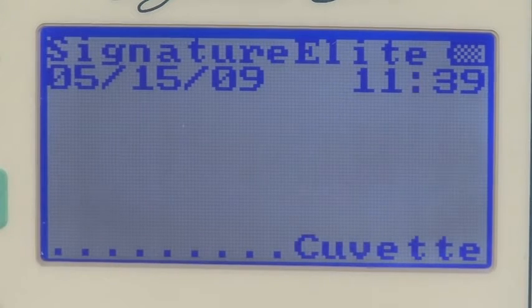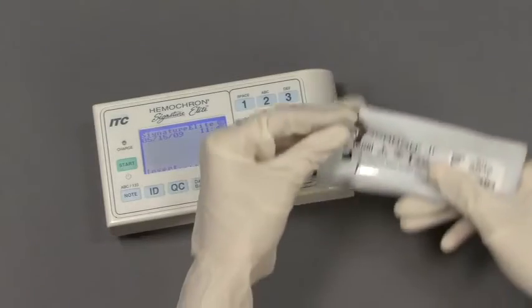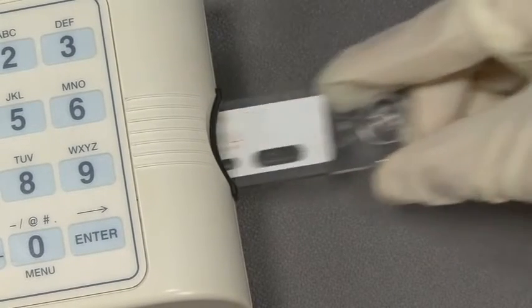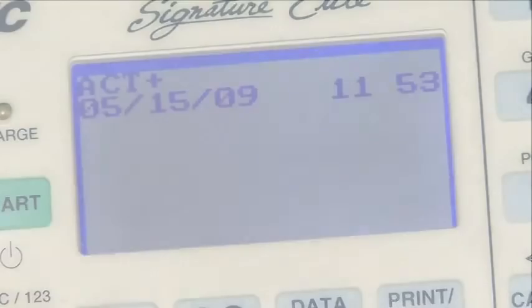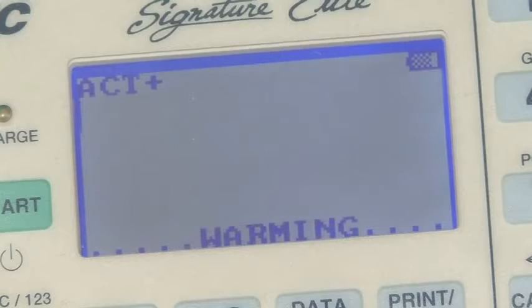First, ensure that the prompt line displays Insert Cuvette. Insert the cuvette for the appropriate test. Elite will automatically recognize and display the cuvette type. The cuvette will warm to body temperature. At this point, cuvette lot and expiration information, or patient and operator IDs, can be entered.